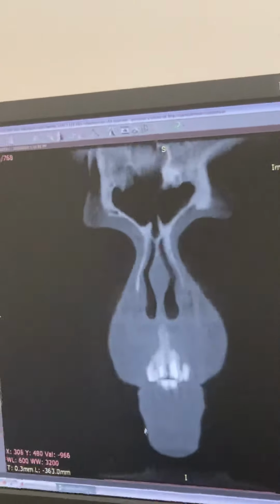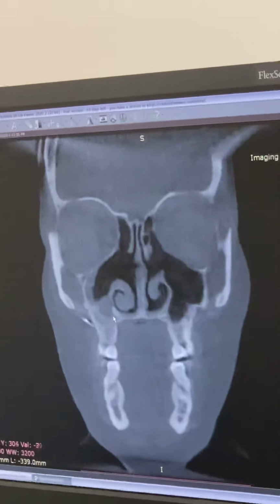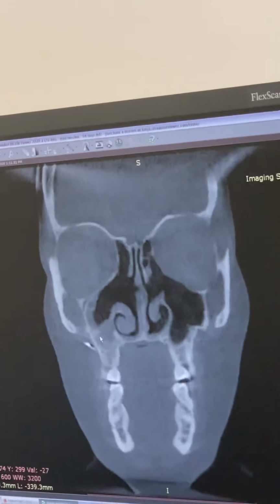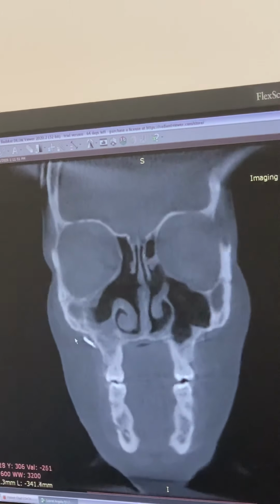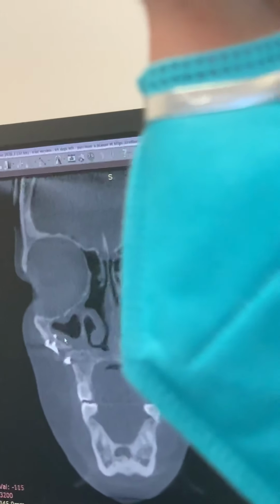It shows. So, front of the nose. Here is your... So you're having inflammation inside here. This is your right side. You've had sinus surgery, but you have plates in there, and the plates are extruding through here and causing inflammation. Are you seeing that here?